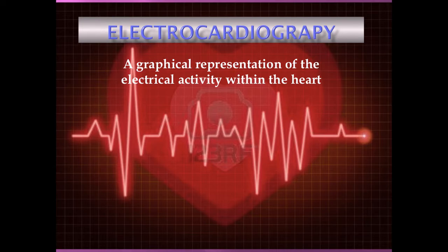Through this, we're able to evaluate pacemaker function, response to medications, and certain baseline recordings before, during, and after a medical procedure. And also, this isn't the main purpose, but it is a great way to measure heart rate, and you'll see that there are various ways to estimate that, which we'll talk about today.